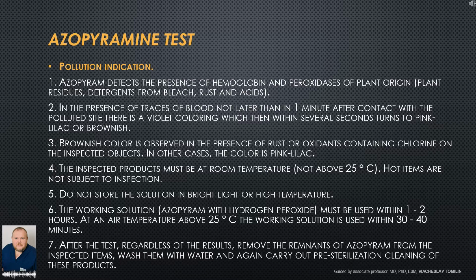3. Brownish color is observed in the presence of rust or oxidants containing chlorine on the inspected objects. In other cases, the color is pink-lilac. 4. The inspected products must be at room temperature, not above 25 degrees Celsius. Hot items are not subject to inspection.